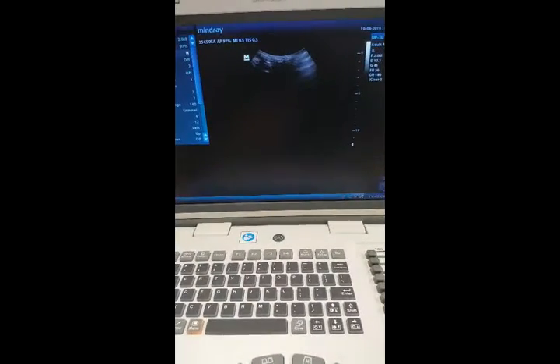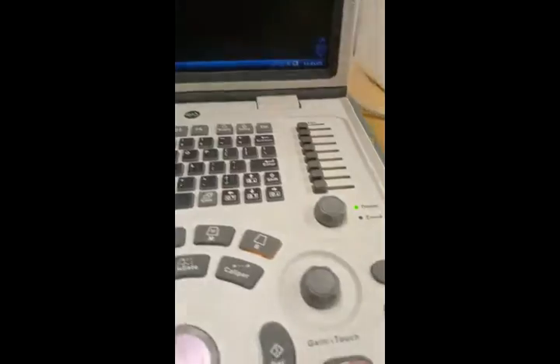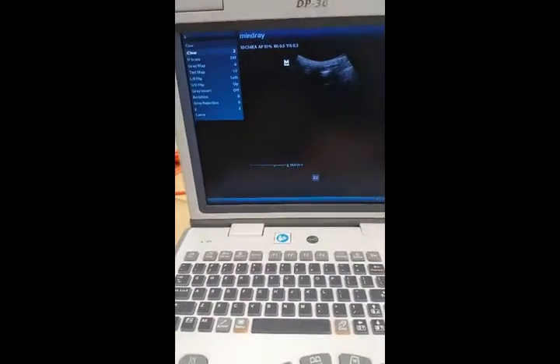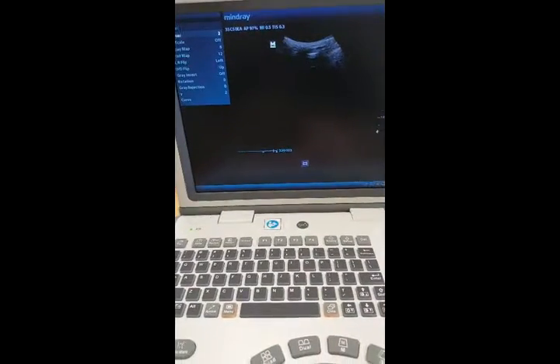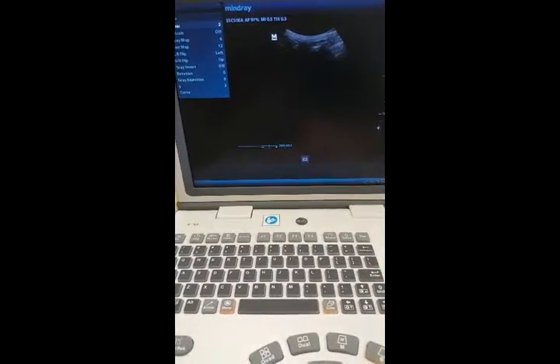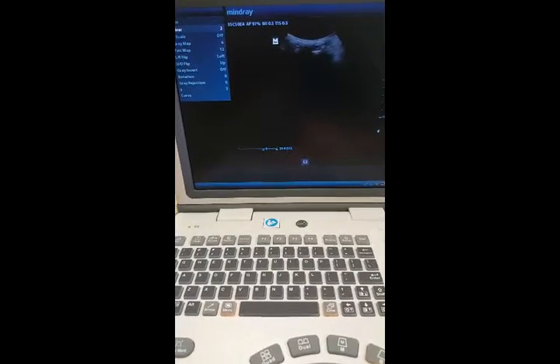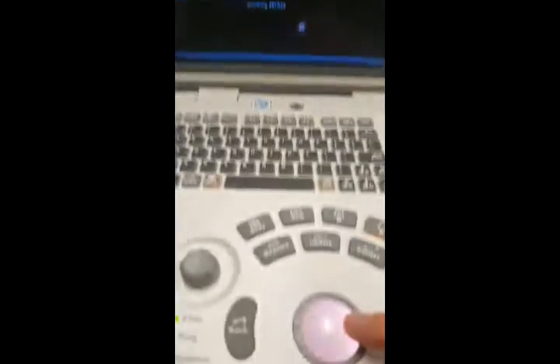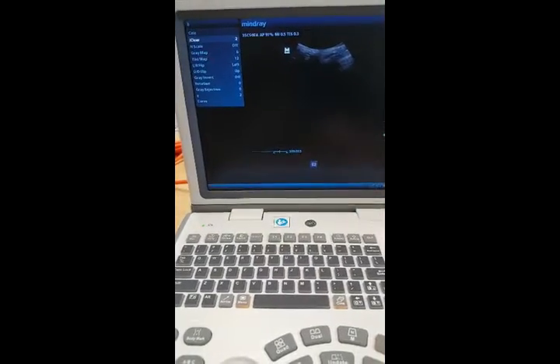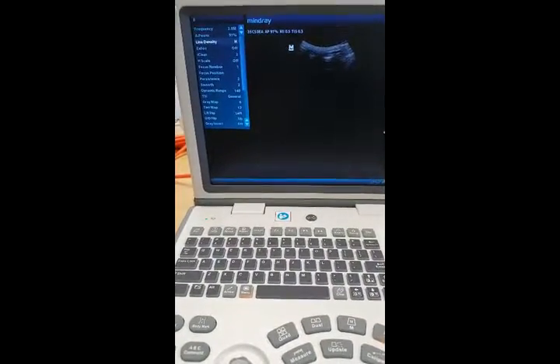Coming back to the freeze function — when you press freeze, then using the trackball you can go back through the recording that you're seeing. You can see it happening here, just going through the last few frames. So you can show patients specific contractions by using the trackball and sliding the frames along. To get out of the frozen picture, just press freeze again and we're back to the live image.